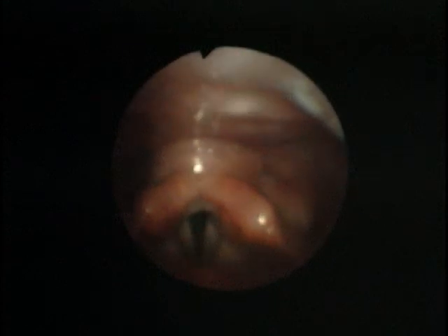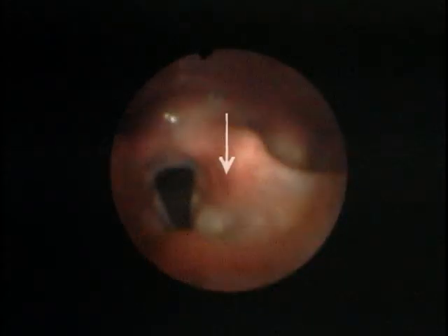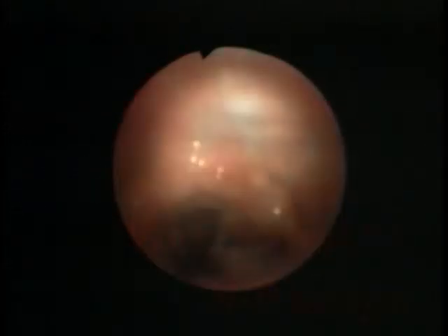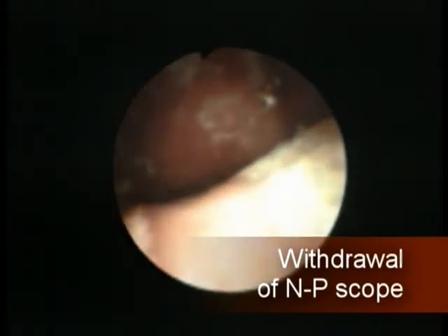Avoid touching structures of the hypopharynx with the scope, since this can induce laryngospasm. One can see clearly the movement of the arytenoid cartilage as the vocal cords are contracted in this example. Upon finishing the complete inspection, withdraw the scope in neutral position. This completes the examination.